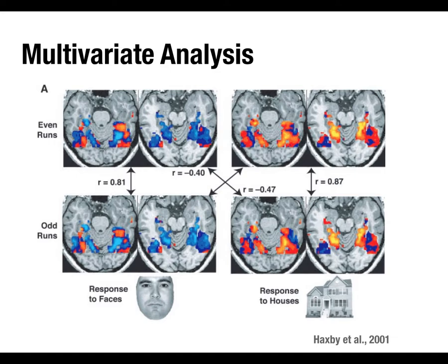And there were some areas that were consistently deactivated, so showed reduced BOLD signal relative to, or another way of thinking of that is more BOLD signal during the control conditions than when seeing faces. And some people might say, oh, we don't care about that. But they were asking, is there any consistency to this overall spatially distributed pattern of activation?